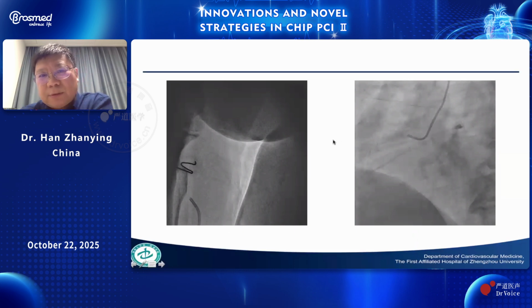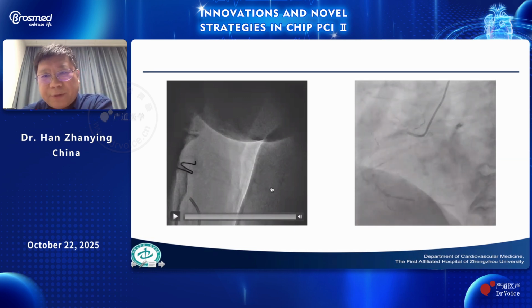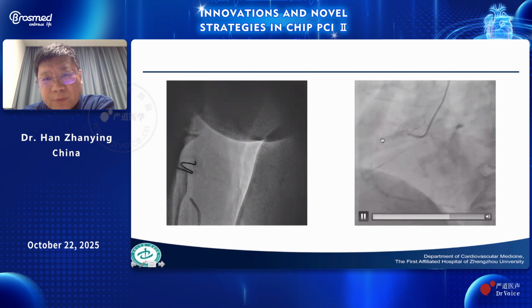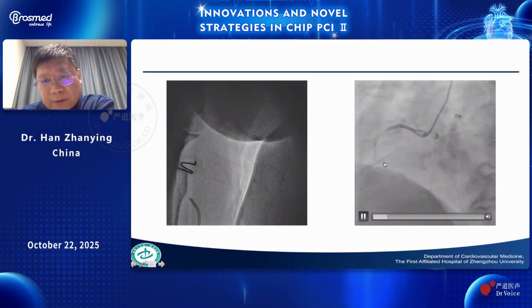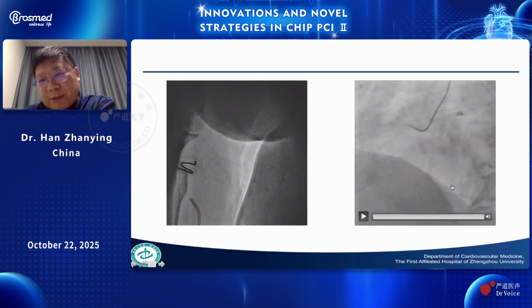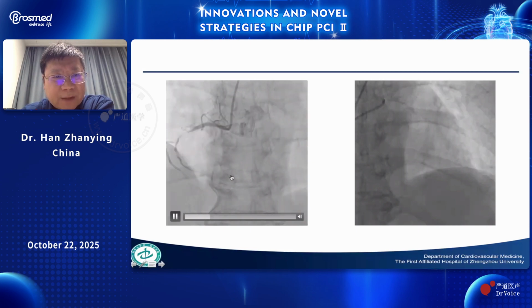So I'll show the result of the angiography, from the right radial artery. You can see the right coronary artery. I think you have noticed the stenosis at the proximal segment, and diffuse lesions and total occlusion at the distal part of the right coronary artery. I'll show you from another view. You see this one, the PLA is totally occluded.